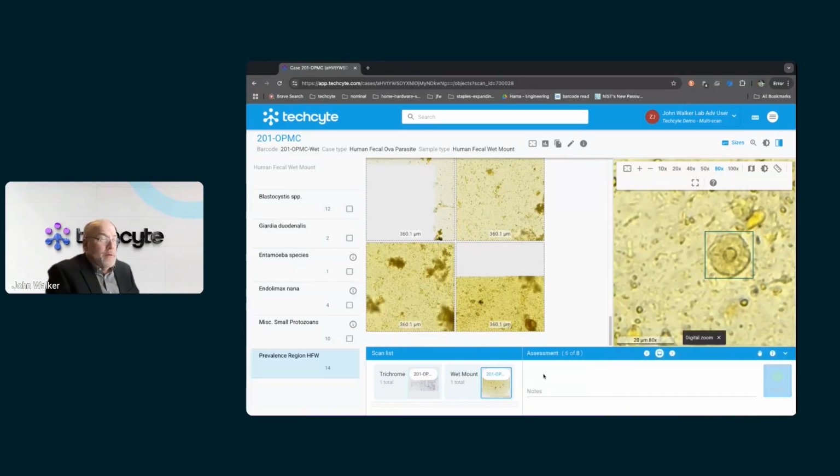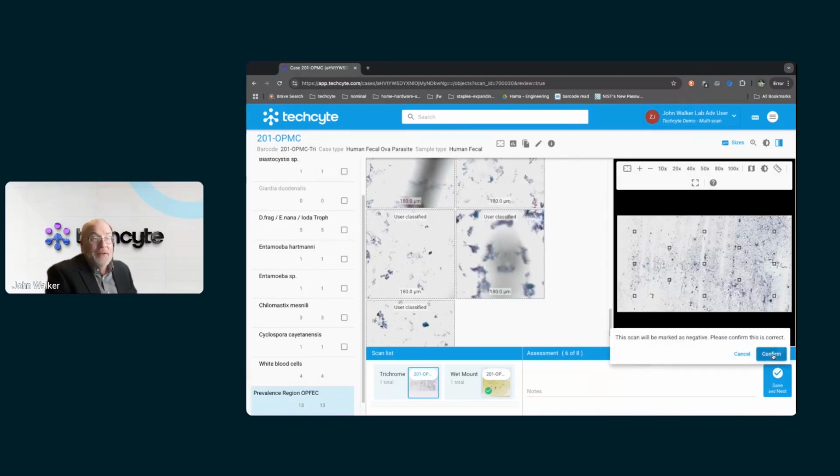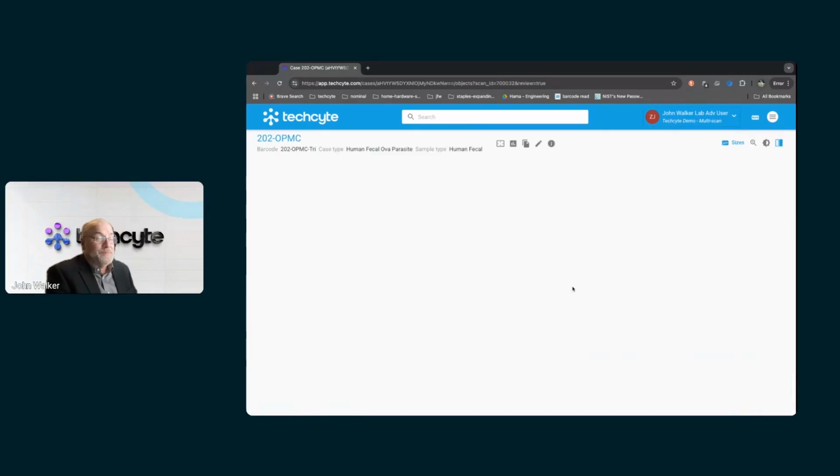and call that done. Now here you'll notice it took me back to the trichrome because it said, well, my friend, you forgot to review the trichrome and give your assessment for that. So before taking me on to the next test case, it took me back to the trichrome. I've already reviewed that. I'm going to confirm it as a negative.